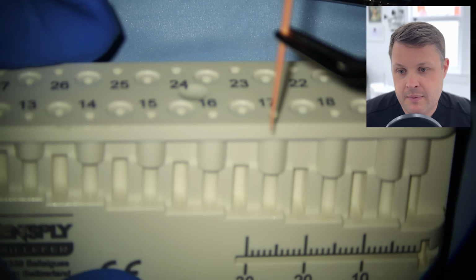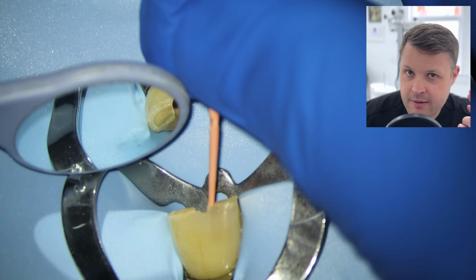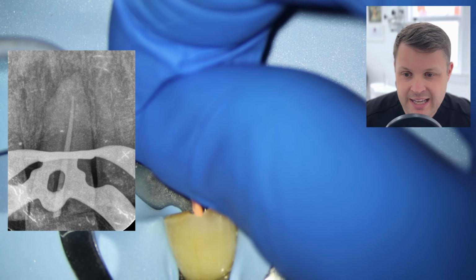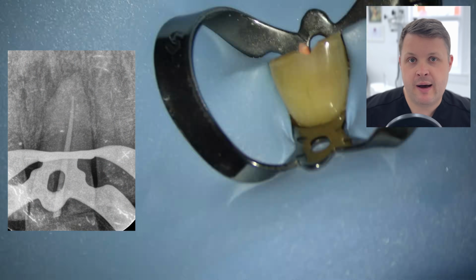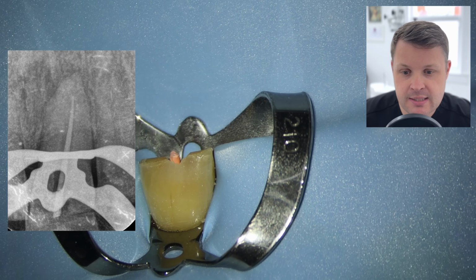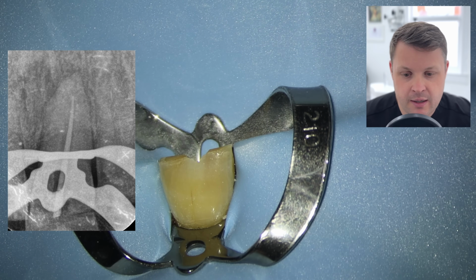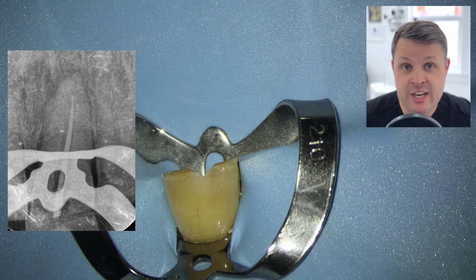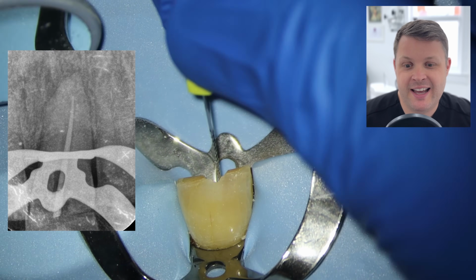I also take a cone fit radiograph of this tooth at this length, and I'm hoping, fingers crossed, that this is at the end of the tooth, but it isn't. It's way short. So this is a strong indication that we're at 0 with our apex locator, but the GP cone is showing quite far away from the radiographic apex. In fact, this is an indication now that we need to take a CBCT, and we can see here that I have caused a very, very small perforation with this tooth.